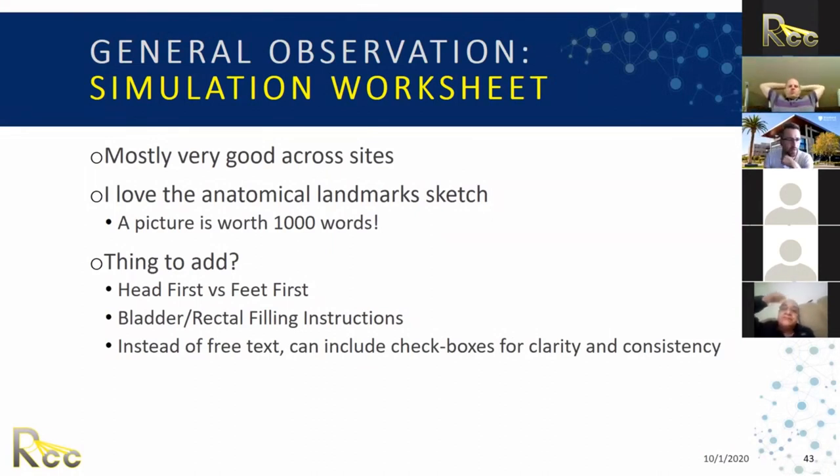Things to maybe think about adding to your sheets: head first versus feet first. It's not often we'll scan patients feet first, but it can happen, and if you don't properly annotate that, it could lead to some laterality issues. So maybe add head first, feet first as well. Bladder and rectal fillings are huge because you need to make sure the patient's internal anatomy is reproduced.